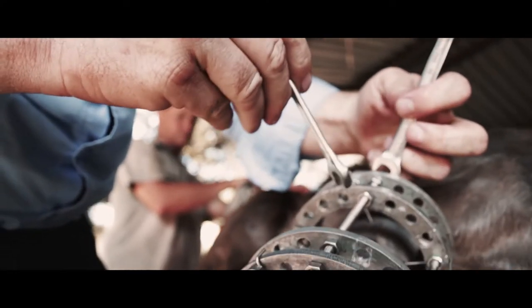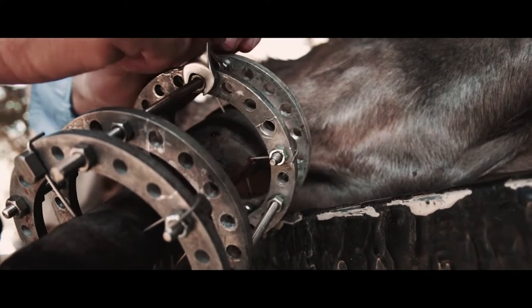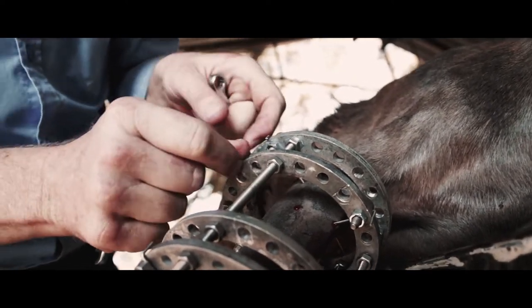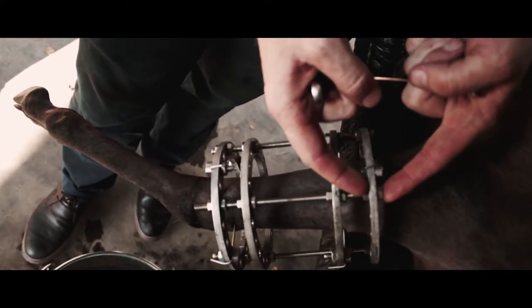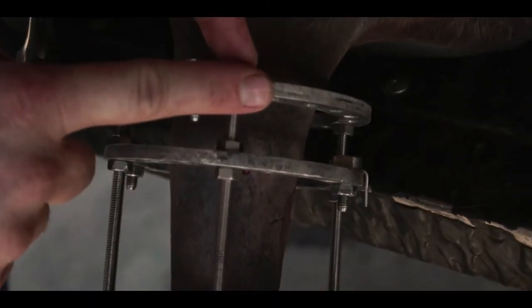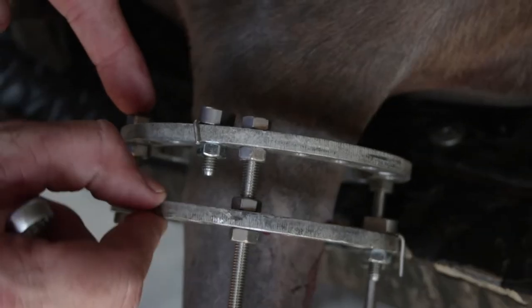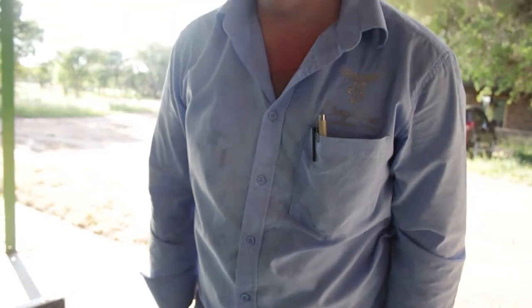You really have to get that righty-tighty lefty-loosey thing going. What I'm doing here is tightening so the ring stays in position - that's the function of it. It keeps everything in position because that's the plane. You're locking the ring in place, otherwise if one was loose it would move. I'm going to give him an intravenous antibiotic - IV straight into the vein. You can see the vein there.